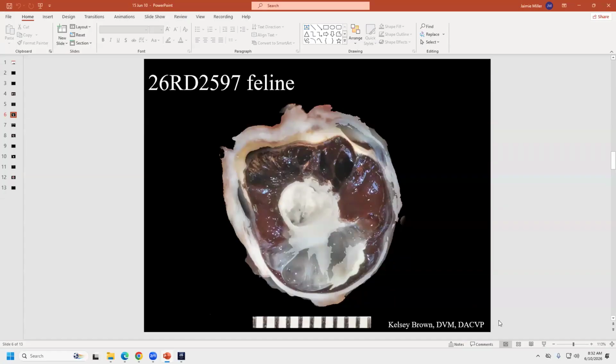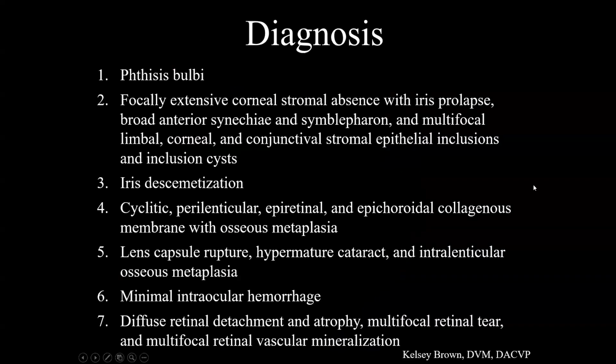And perhaps I should have gone to my diagnoses as I talked about this. So yeah, just a long laundry list of diagnoses here. I do suspect maybe we do have feline early life eye disease at the very least, just given how the anterior segment looked, and can't rule out there being some sort of concurrent trauma or even an underlying congenital etiology. In this particular case, they said the other eye was normal. So honestly, this distinction is perhaps academic as well, but it is fun to discuss and think about. And that is what I have for this case.